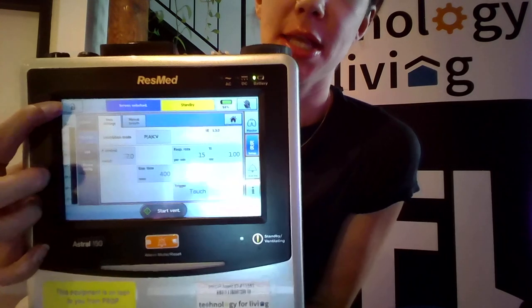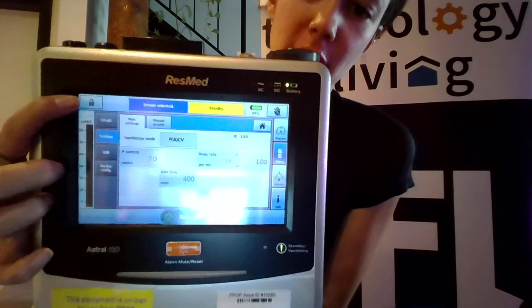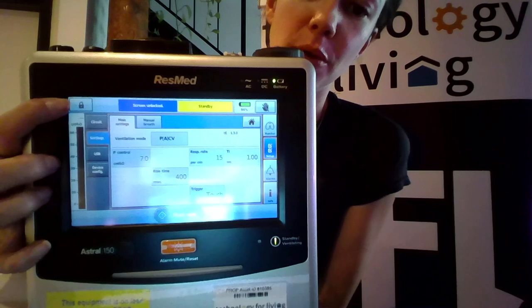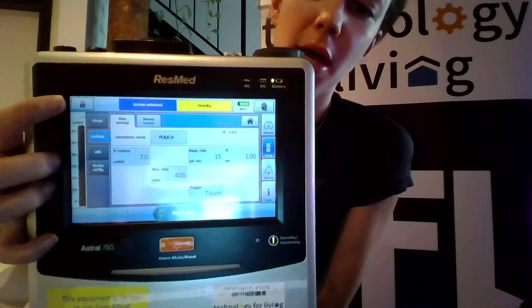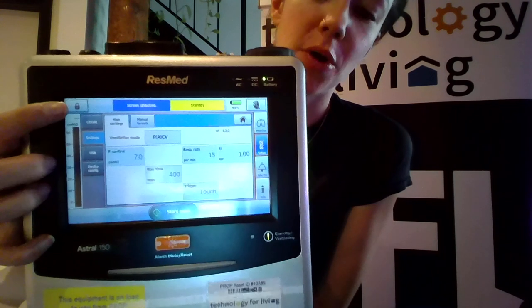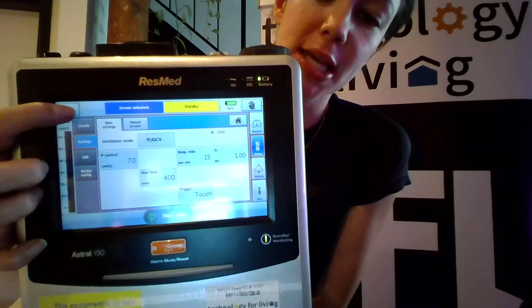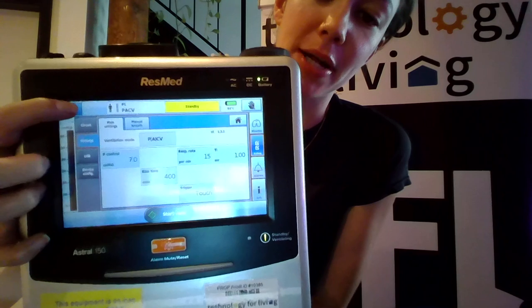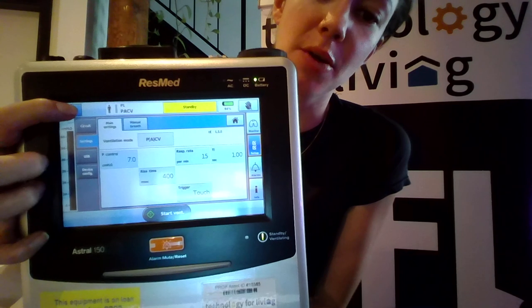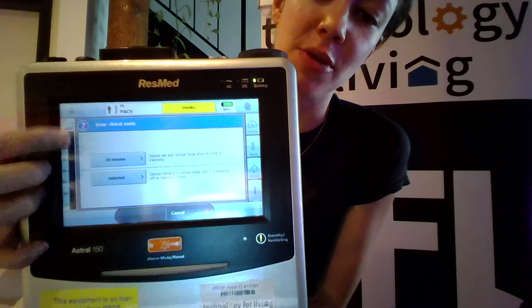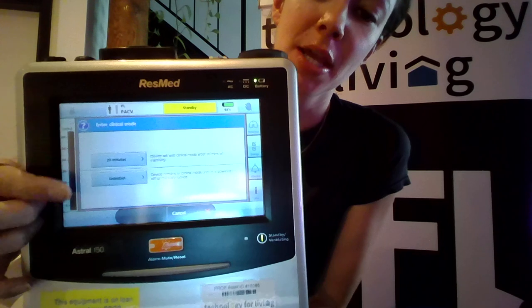Now we'll see at the other corner we've got this lock symbol, so we'll need to unlock or go into clinical mode. We'll press and hold that button until it's highlighted in blue and keep pressing until we get another menu that pops up.